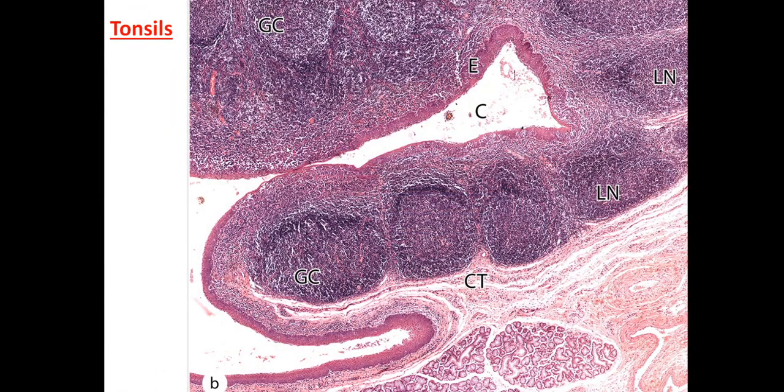This is the histological feature of tonsil. This is the lining epithelium: stratified squamous epithelium, non-keratinized.